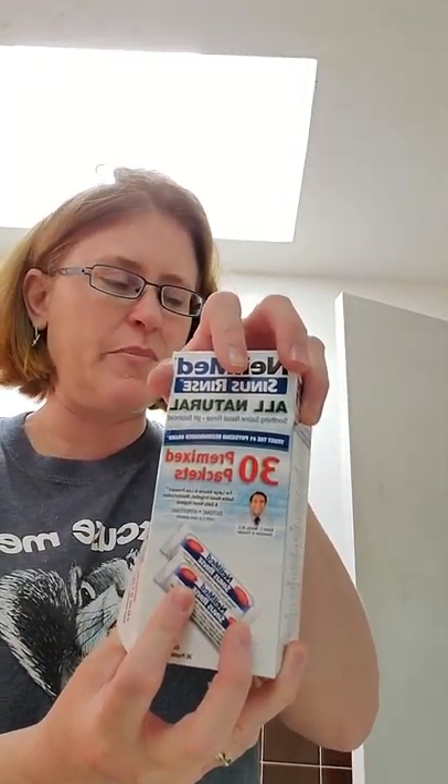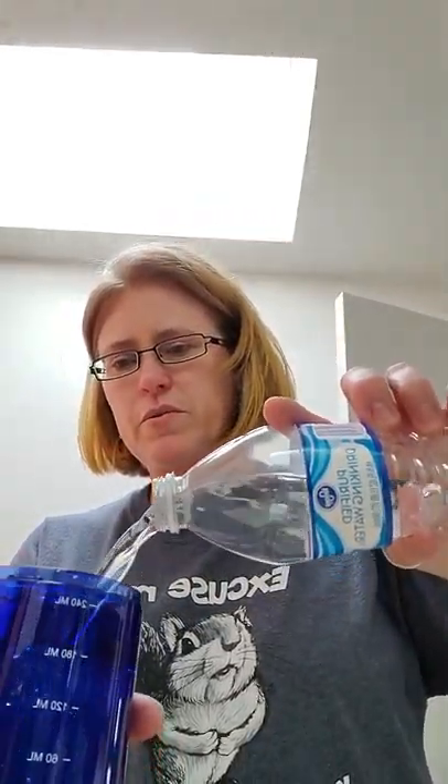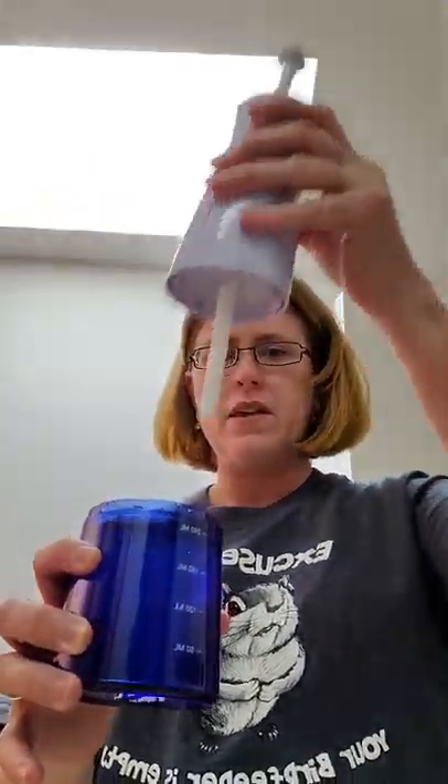Also in the box, you get 30 pre-mixed packets. They make the water the right pH so that it's compatible with your body. It comes with a little container here — put the water in, then pour the little packet in. Usually use distilled water, filtered water, or any commercially bottled water. I've just got Kroger drinking water. Fill this up to the eight ounce mark.